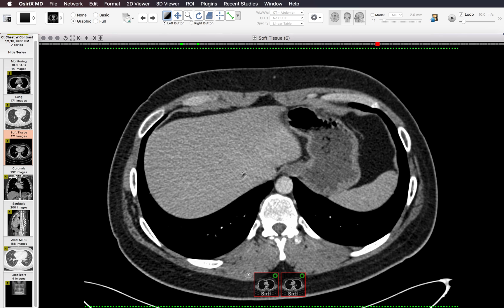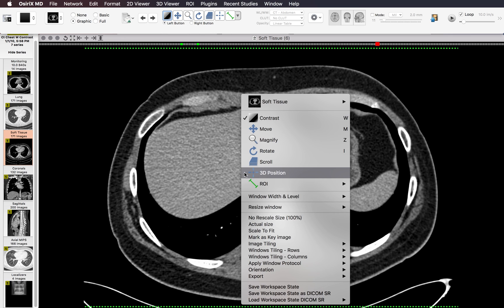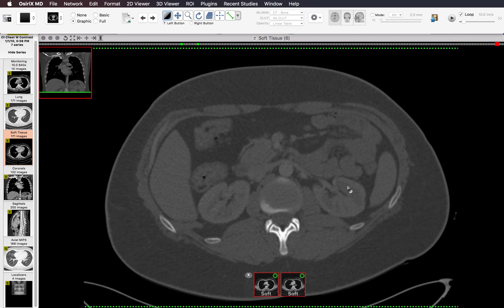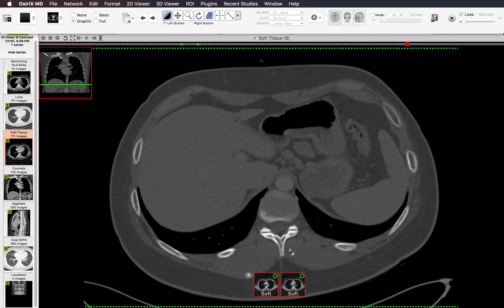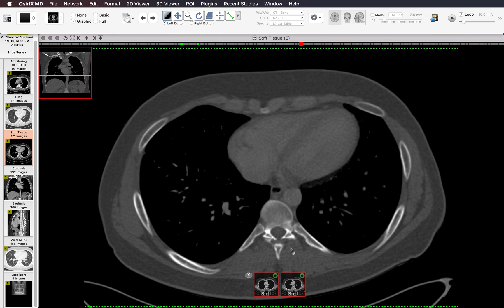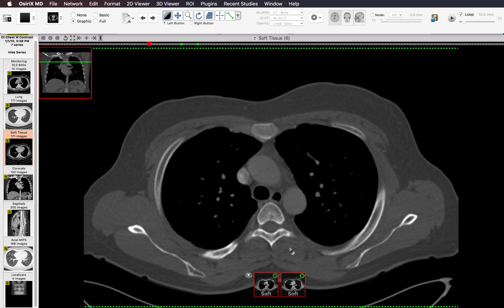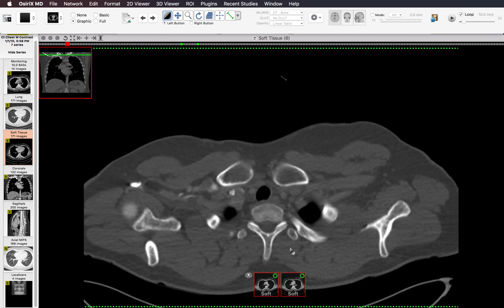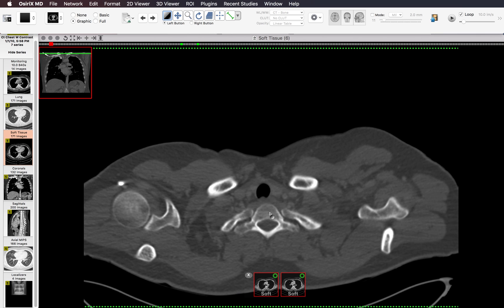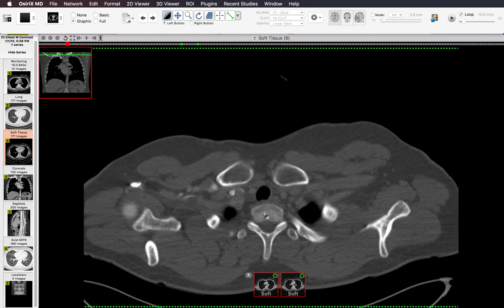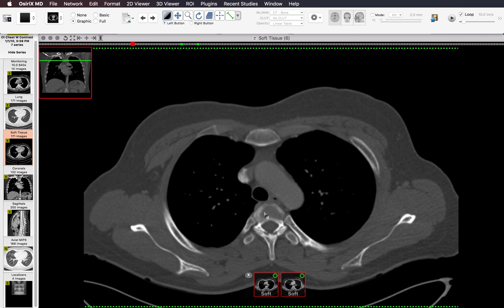Next I look at the bones, changing to bone windows and starting at the bottom with the vertebral bodies. On the axials I'm looking for sclerotic and lytic lesions. It makes a big difference if you know the patient has cancer — a sclerotic lesion in a patient without cancer is probably a bone island, but in a patient with prostate cancer you would call small sclerotic lesions suspicious for metastatic disease.